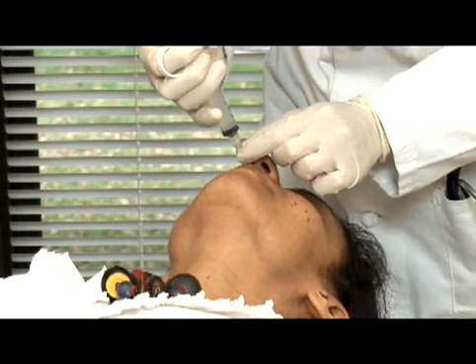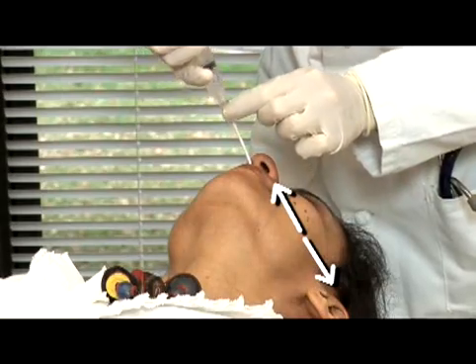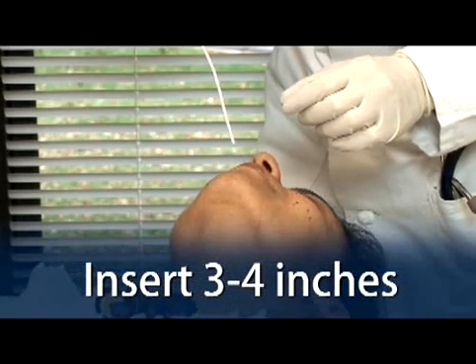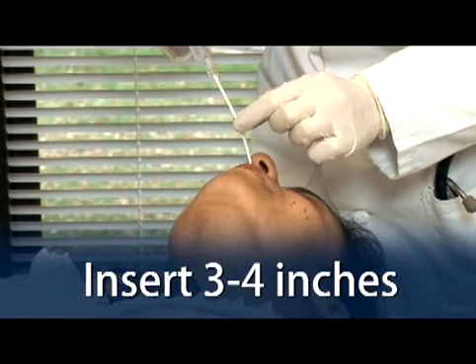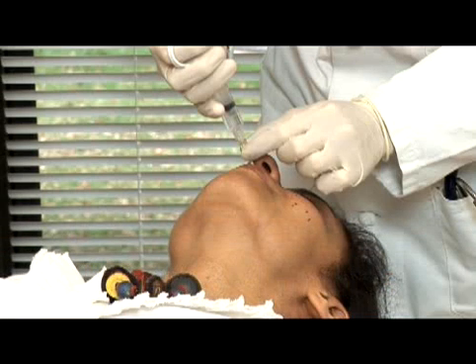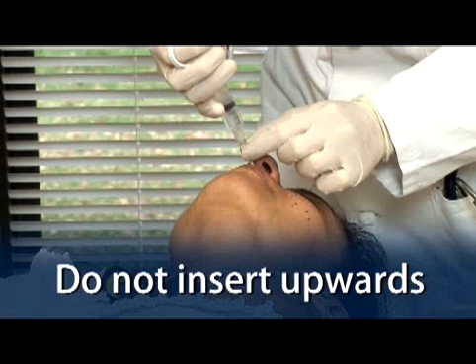The distance from the nose to the ear gives an estimate of the distance the tube should be inserted. Insert the tube about 3 to 4 inches — less for a child — into a nostril, aiming posteriorly along the floor of the nasal cavity until reaching the posterior wall of the nasopharynx, being careful not to insert it upwards. If an obstruction is encountered, try the other nostril.